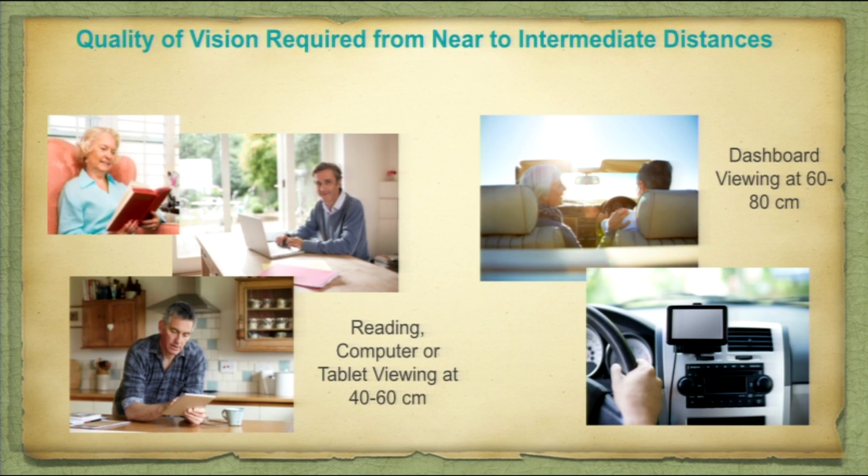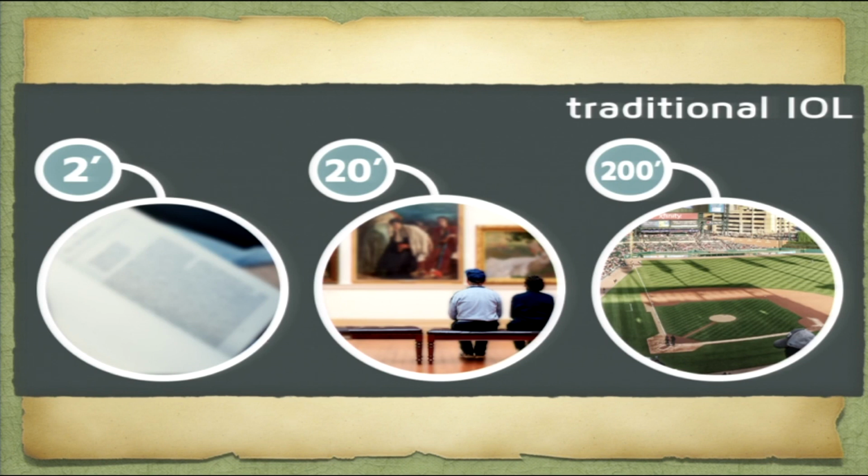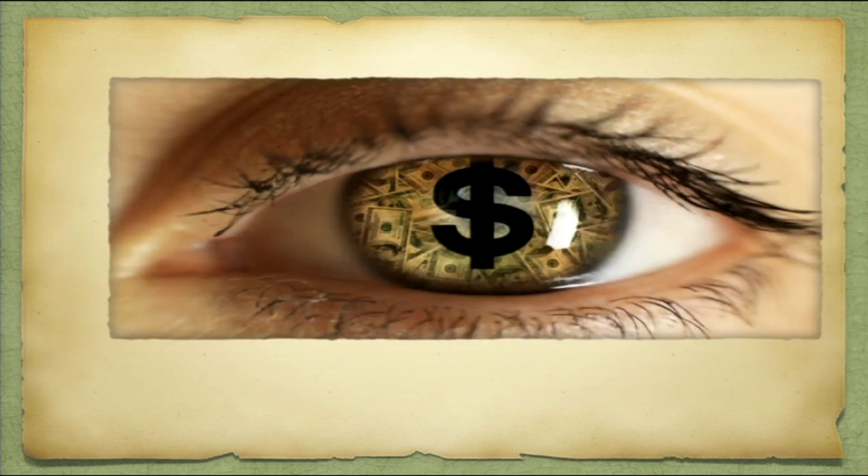The ideal intraocular lens should restore vision at all distances, especially now with smart dashboards, computers, tablets, and mobiles. Our intermediate and near distance has come more into prominence. With traditional lenses, the best case scenario was good distant vision, whereas an excellent option for patients from 45 to 60 is when they want distance, intermediate and near. That is why these days most energy and funding is on the development of new and complex IOLs.